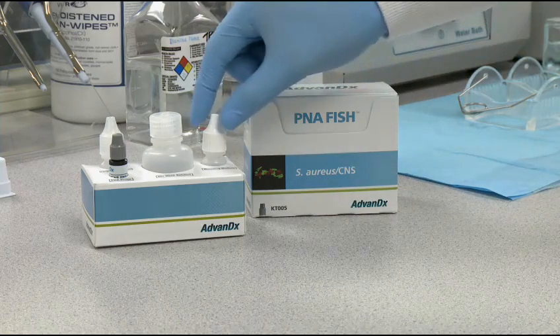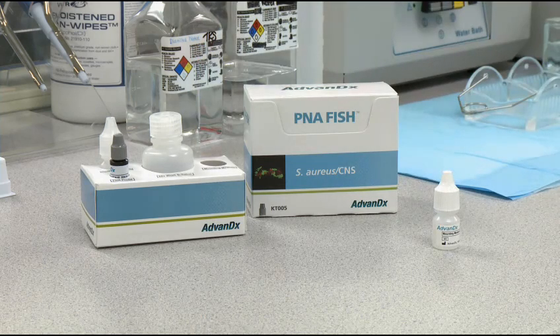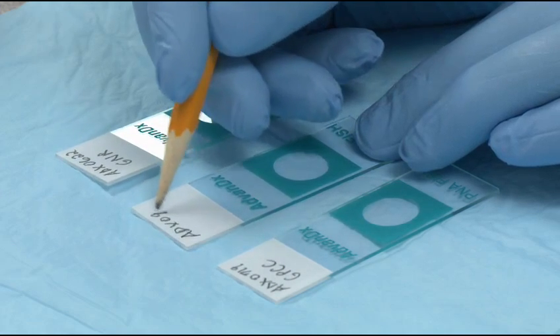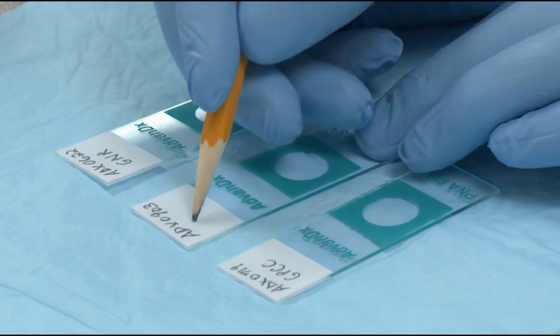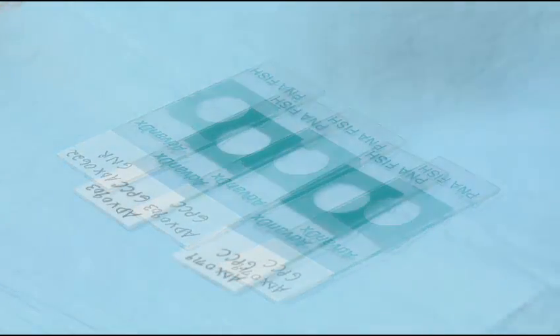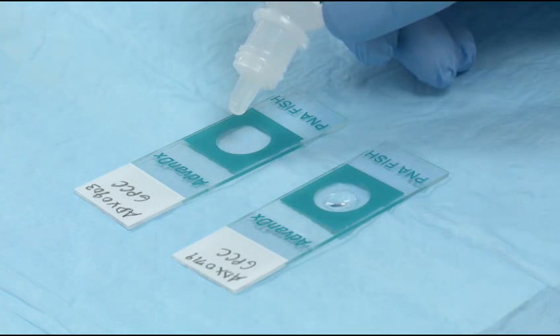And lastly, remove the mounting media bottle from the kit and allow it to warm to room temperature. Label slides with sample identifier and the appropriate gram stain result. Add one drop of fixation solution to the well of each microscope slide.